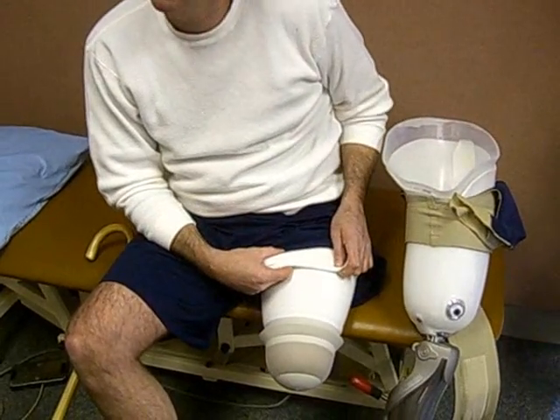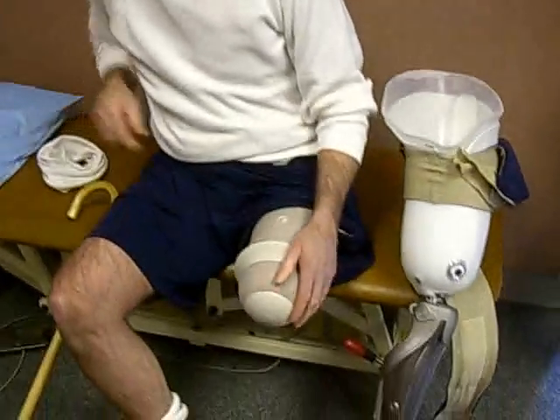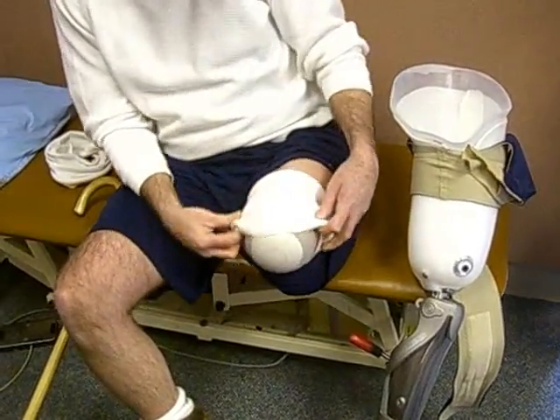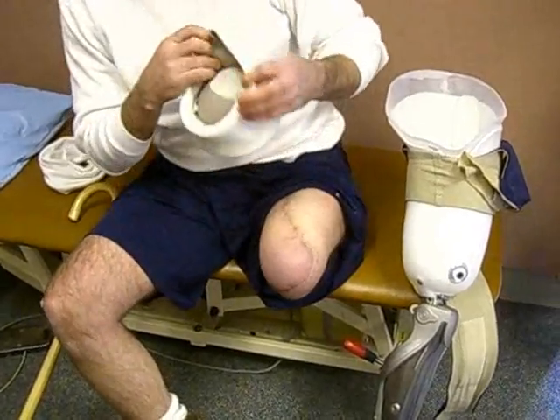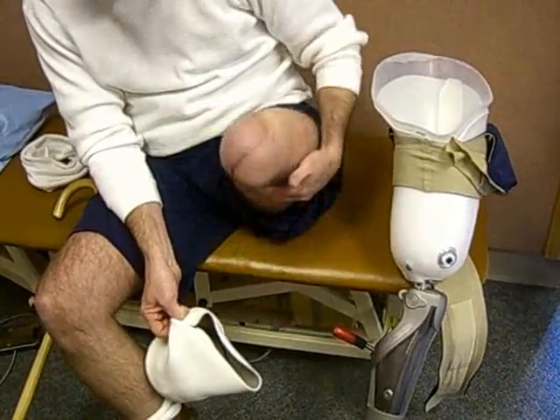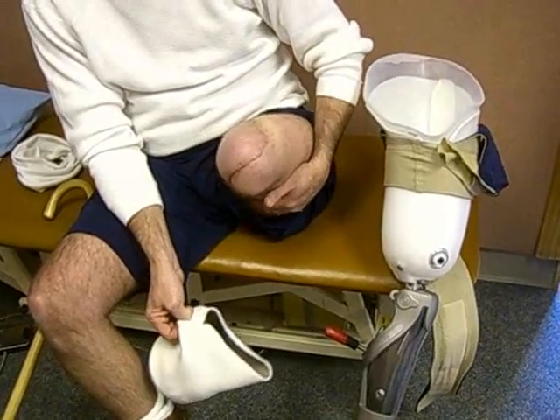I wouldn't call it discomfort really. It doesn't feel like 100% part of you yet. But every day it starts to feel more like it. You know, 41 years of having a leg on and 2 months of just this. And do you get any phantom pain at all? I still get the phantom pain. Well, not so much a phantom pain, it's more stump pain. That's all my bone here. This muscle right here, I need some work on.